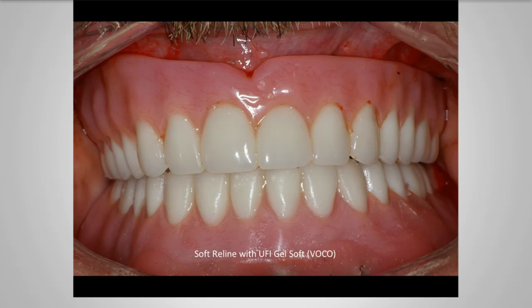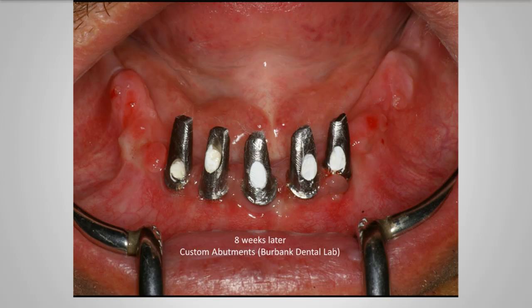When looking at the discrepancies in jaws, we're focused more on the upper arch and where the midline is, not the lower arch. Either due to discrepancies in arch form or crossbite, sometimes the midline in the lower arch will not correspond with the midline in the upper arch. Most people will not notice that. We as dentists will, but for patients, they're happy that they have white, bright teeth that function and that they can smile with. So as long as your midline in the upper arch is ideal, that is very good.